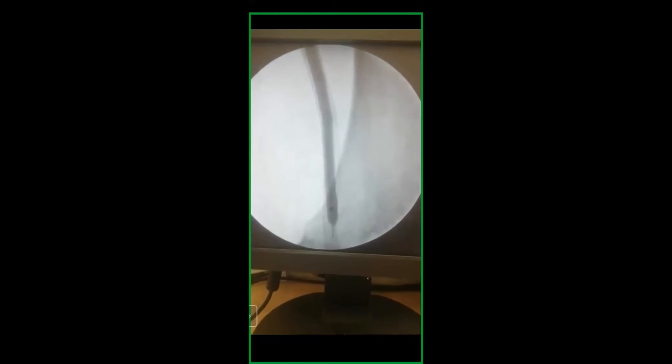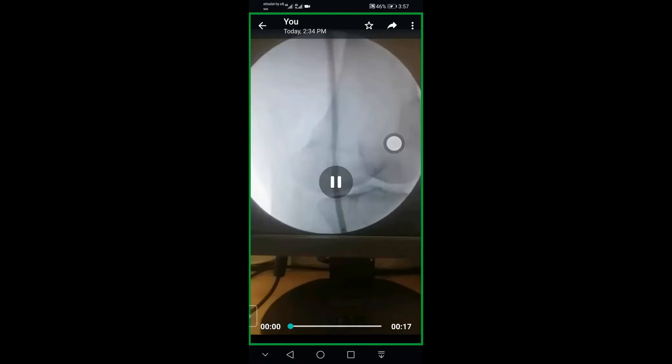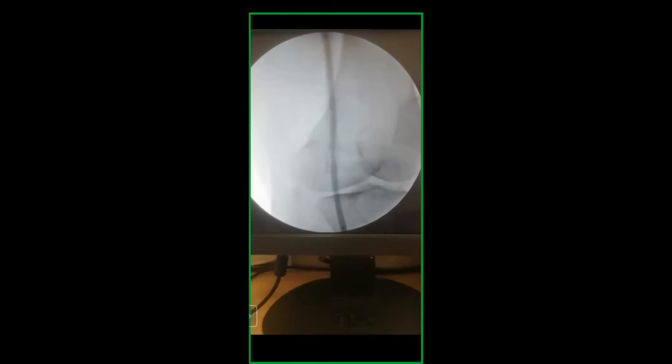Here we can see the overlap area — it's a very tough part, as shown by the waist in the balloon. Another challenging part of this case was that after advancing the wire to the distal stent and at the P1 popliteal region, we couldn't cross the wire through the very tough lesion in the distal part of the stent.